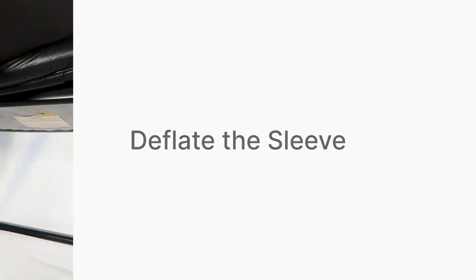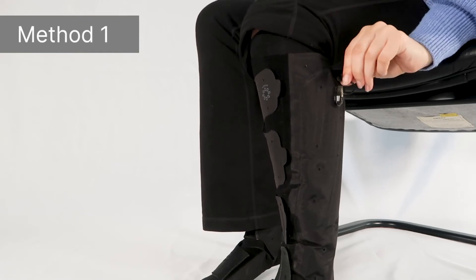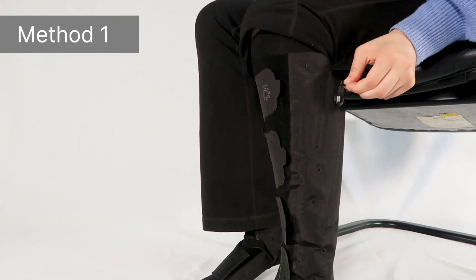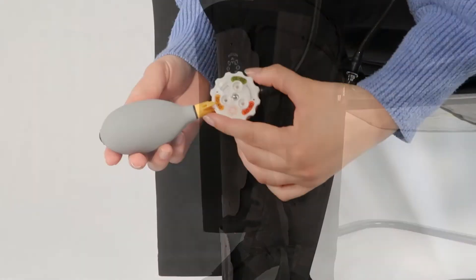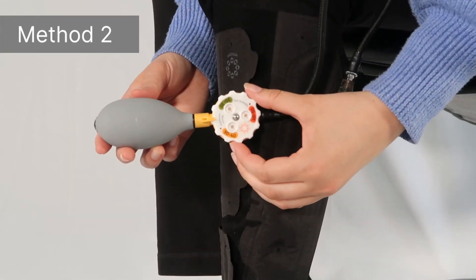AeroWrap can be deflated by turning the valve cap upside down and inserting the stem side into the valve for a quick release. Or, attach the AeroGauge and spin the dial between two pressure ranges.